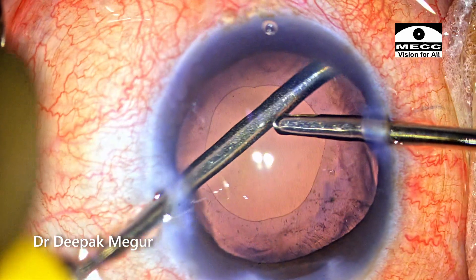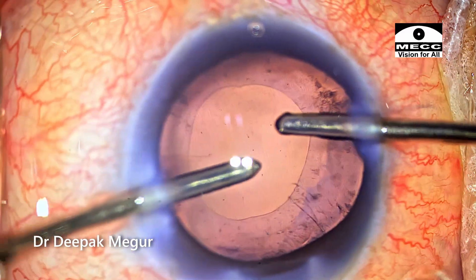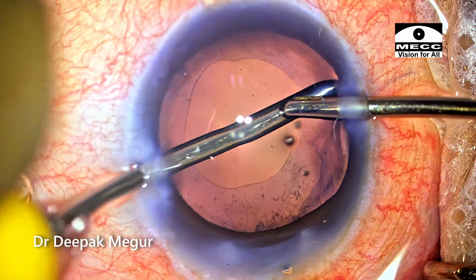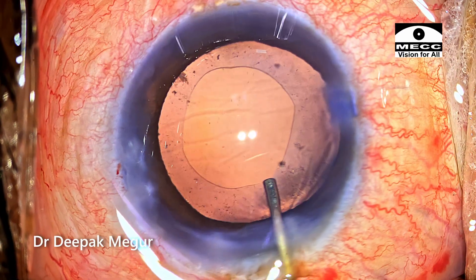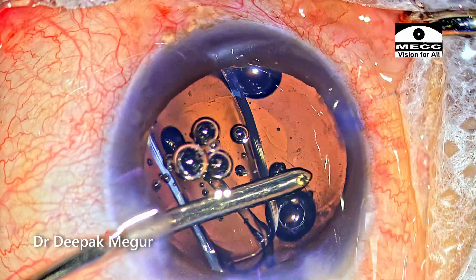Cortex aspiration is being done using bimanual I&A, and thankfully the zonules look to be very healthy so I have abandoned the idea of putting any CTR into the eye. Once the cortex is aspirated, the bag is inflated with OVD and a single-piece hydrophobic lens is implanted into the eye.